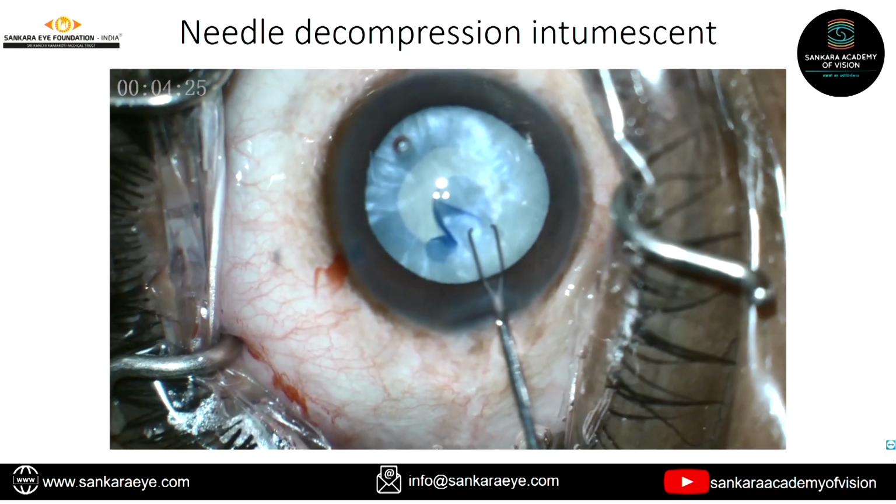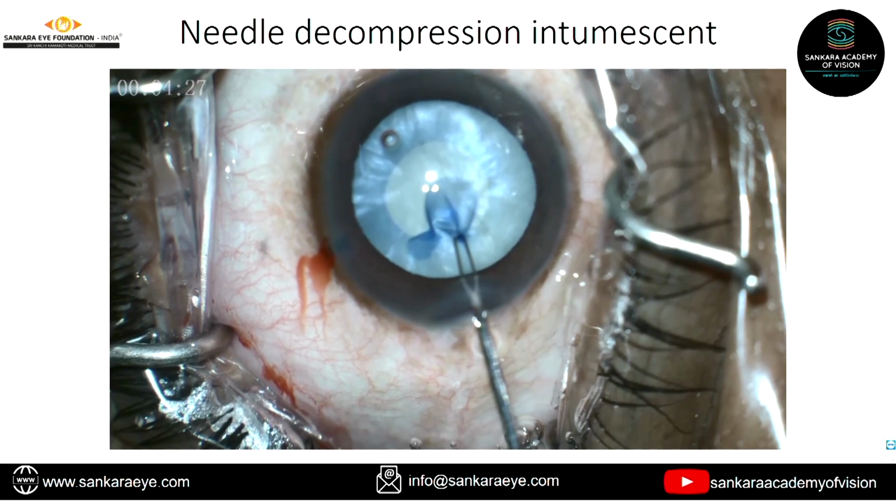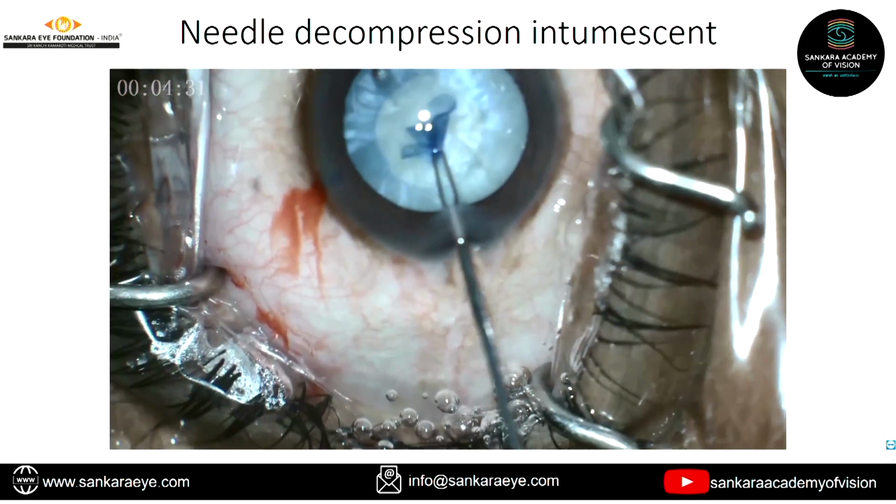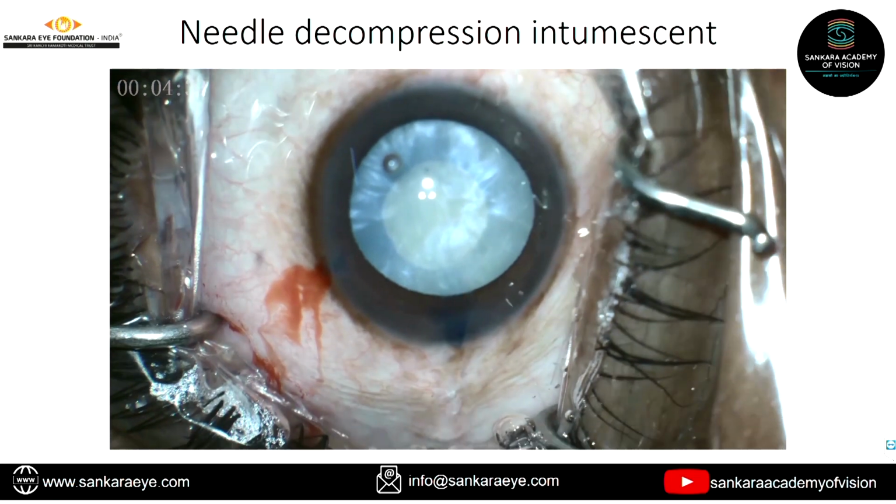So once you decompress the eye, you have enough space. The lens is not bulging up, so you can do a very good needle decompression for intumescent cataract. So don't try to go directly. This prevents the Argentinian flag sign. You can complete the phaco.